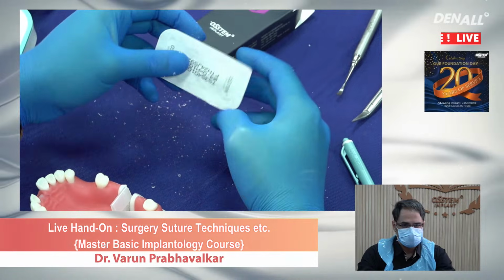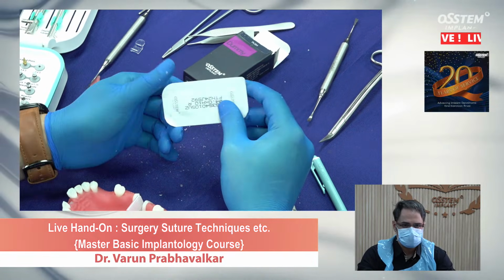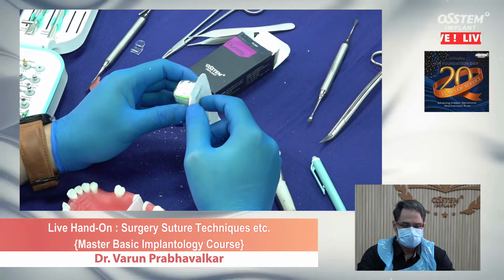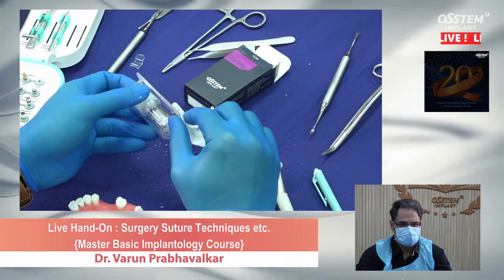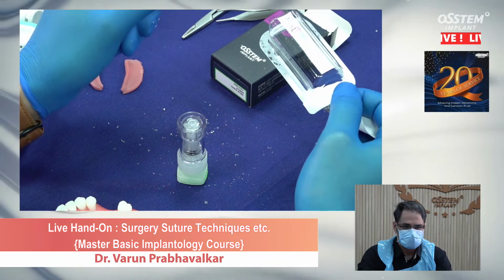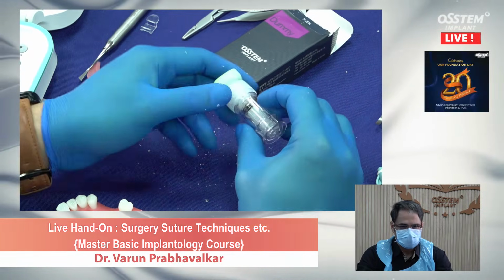And this is what we have as a dummy implant. I'm going to open it just to show the packaging. Till now, this is not a sterile packaging, although the inside portion of this is sterile. So remember, your floating assistant will open this and drop it on the sterile trolley. Just imagine this to be the sterile trolley. This entire thing is sterile.